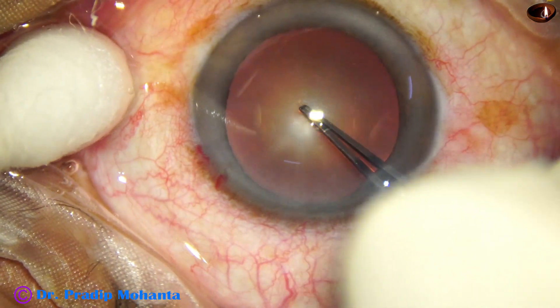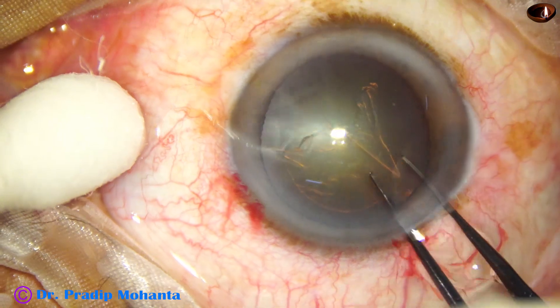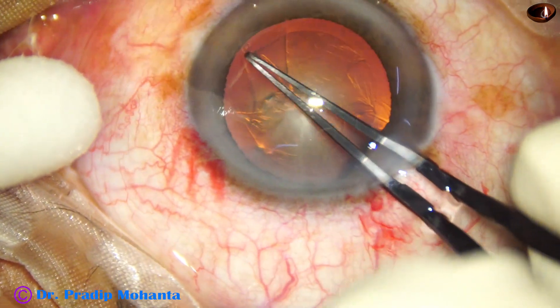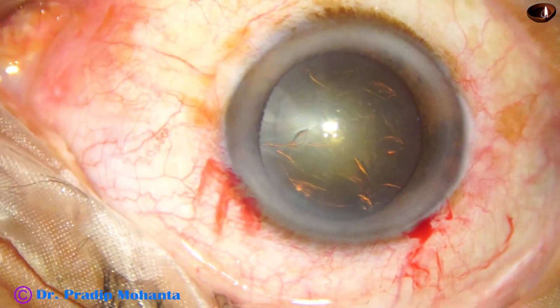Now capsulorhexis is being done with the help of a Utrata forceps. See how quickly we can do a rhexis with the help of a Utrata forceps — it is round and of optimum size.